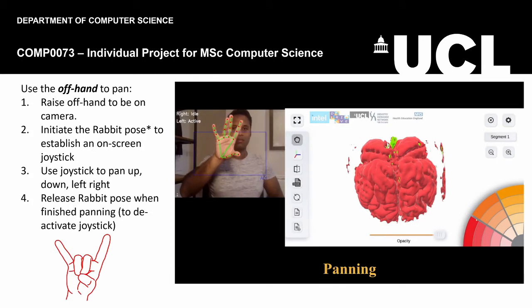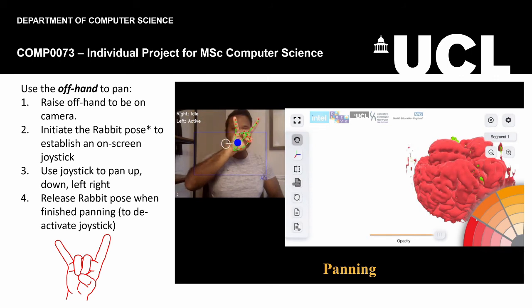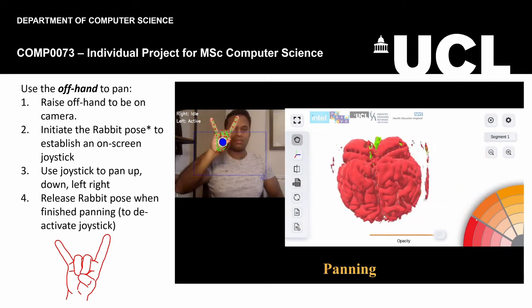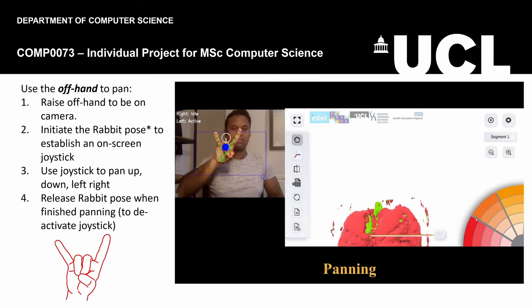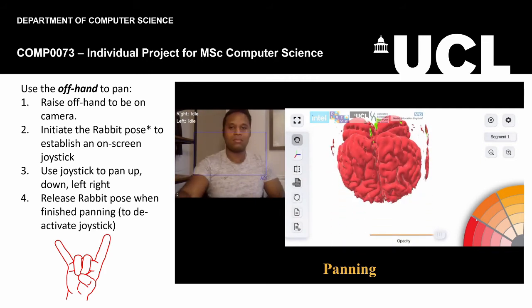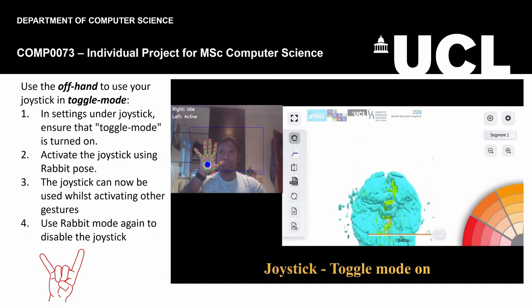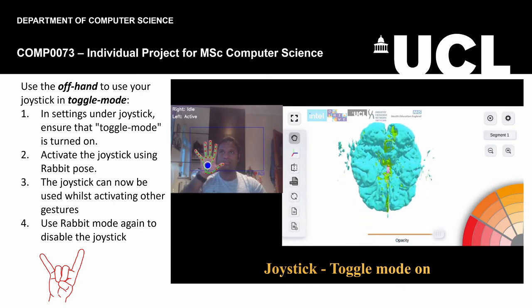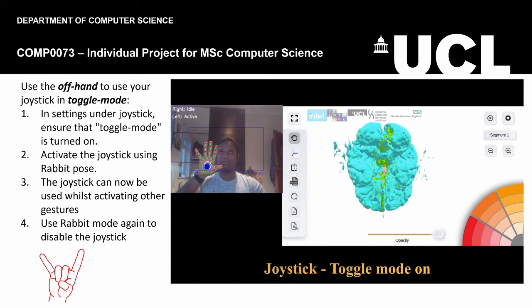Panning is performed by engaging the rabbit pose on your non-dominant hand to bring up an on-screen joystick. You get 360 degrees of motion with it, and you could potentially find other applications for this, like in video games. For the panning joystick, I've created another mode, which I call toggle mode. You do a gesture to activate it, you move your hand as you need, and your palm is open so you can do other gestures and other activities if you'd like, and then finally to deactivate it, you use another gesture.